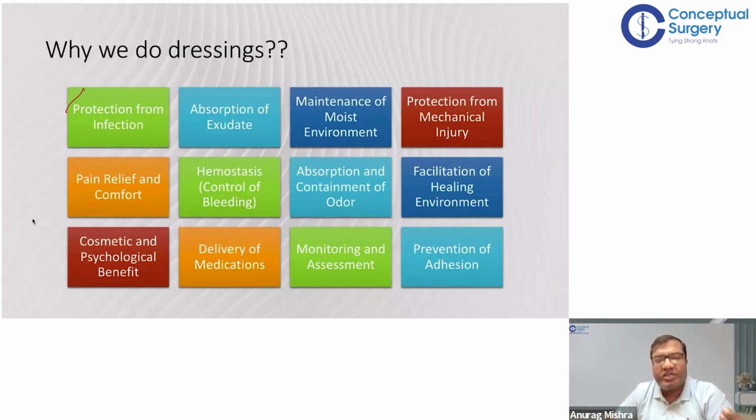Monitoring and assessment. Yes, we can directly visualize, but we also monitor a wound by how much soakage there is. So we can say that yesterday it was a 2-pad soakage, today it was only a 1-pad soak, and maybe today is just a gauze piece soak. In this way we also understand whether the wound is improving or not improving. So dressing is also used in monitoring and assessment of the wound.